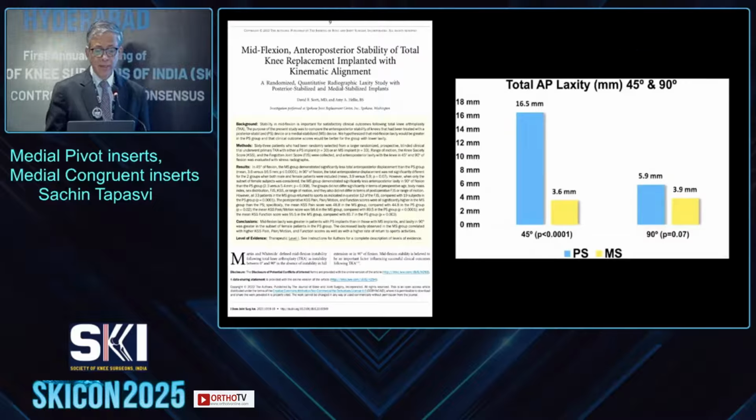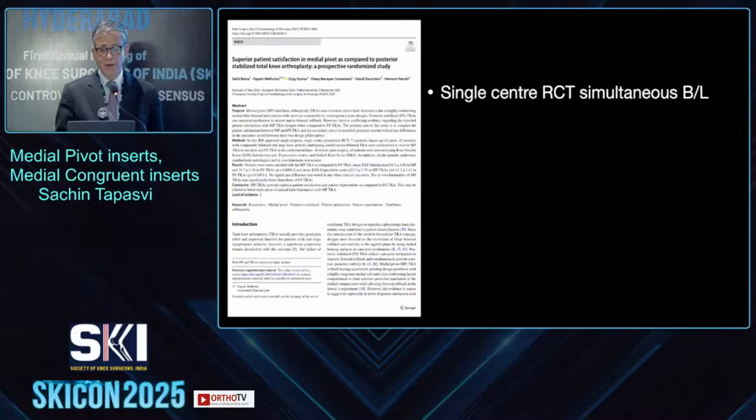So what does that mean? It means that in the mid-flexion range, because of a congruent ball on socket, you will have very good sagittal stability for your MP design, which is extremely useful with the added advantage that you do not need to cut a box. So what about patient satisfaction?